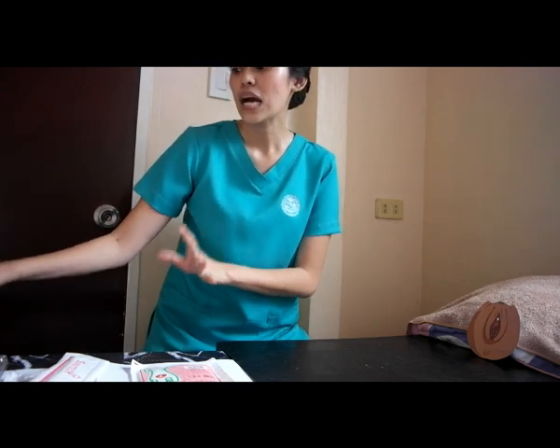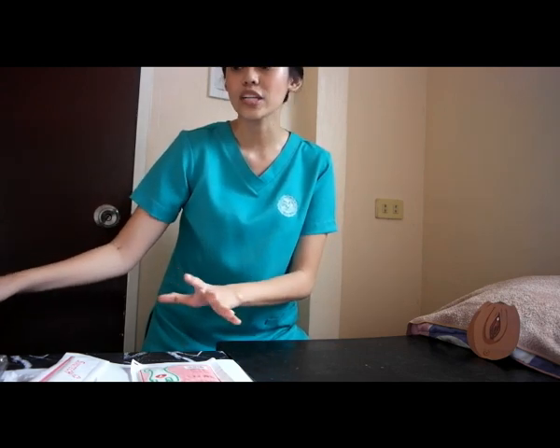Make sure that if you're right-handed, you're standing on the right side of the client and vice versa. If you're left-handed, you stand on the left side of the client. And to start with the procedure, we wear our sterile gloves. So basically this side over here is the sterile field, and while inserting the gloves, make sure to maintain the sterility.